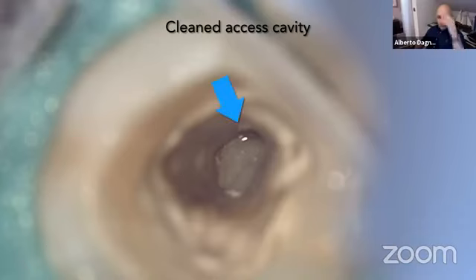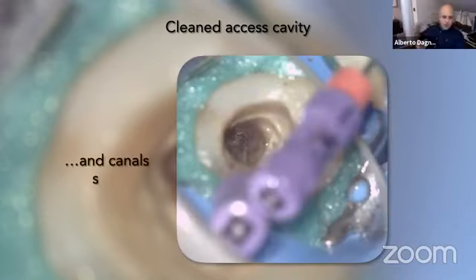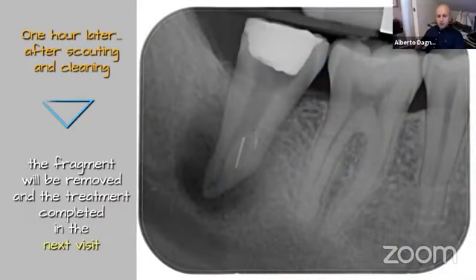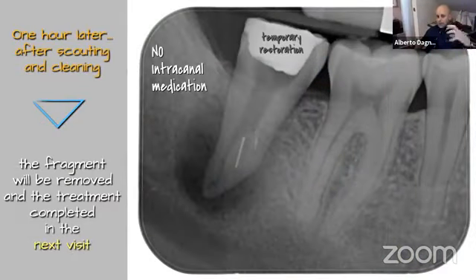This is the floor of this tooth at the middle third of the root, where there was a trifurcation of canals, and in one of these canals the fragment was broken. I cleaned, I disinfected, and after more than 1 hour of work inside this canal, I scouted the canals, and I put a temporary filling, because the patient was a little bit tired, me too, and I had no more time at disposal for concluding this treatment.